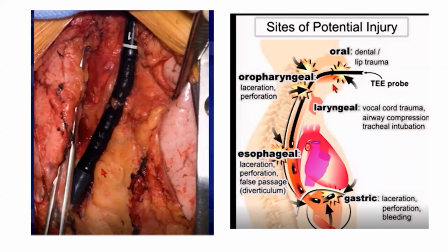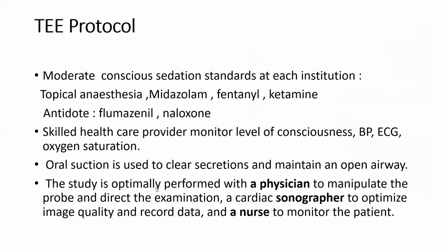And as I told you, in the last 5, 6, 7 years, working here in the Prince of Tamim, we never saw this complication, because we are very cautious regarding the introduction of the probe. Of course, we have to take a very good history. If the patient has any symptom of dysphagia or some esophageal surgery before, you have to stop this and refer him to another modality.